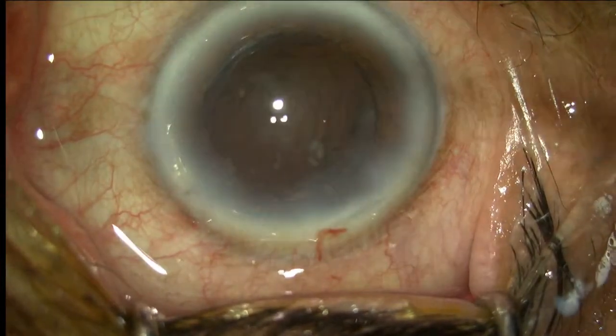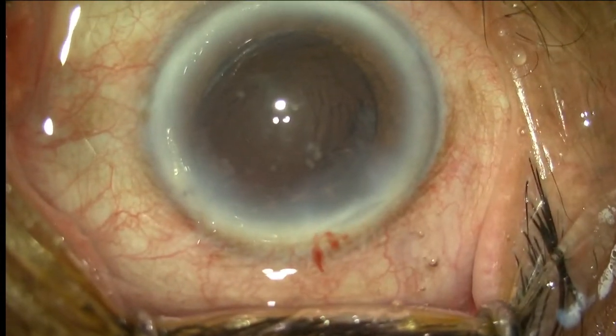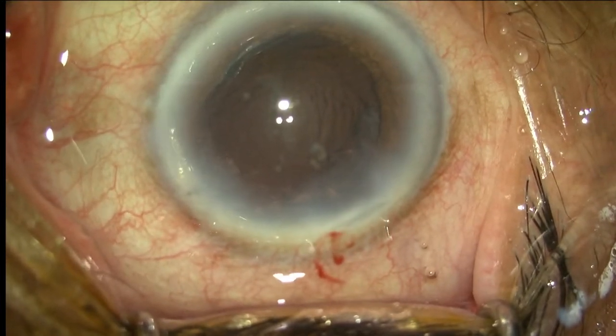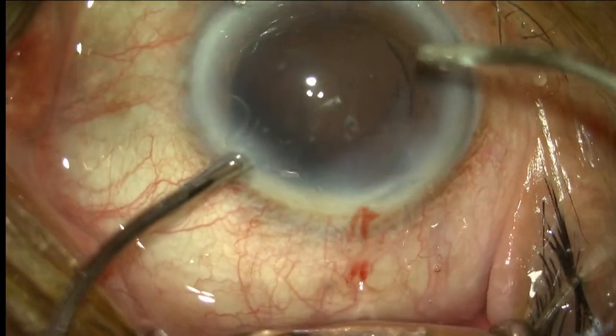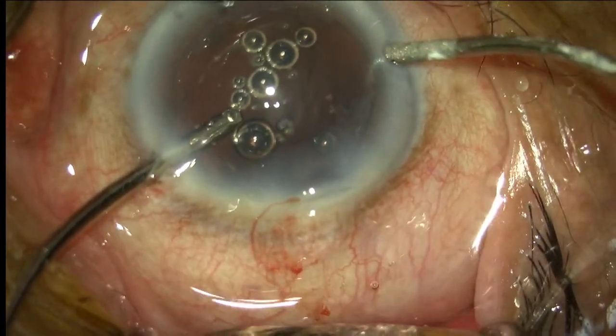So very little cortex is left now. I normally use bimanual only for the aspiration of the cortex, and this is my preferred technique. I don't use the coaxial. I normally use bimanual because it becomes very easy to remove the cortex with the help of the bimanual technique.